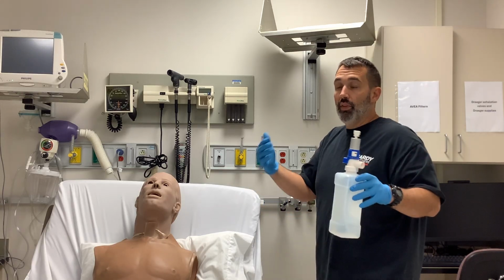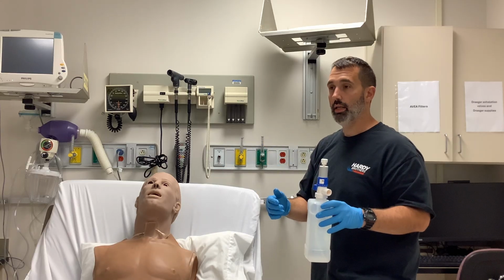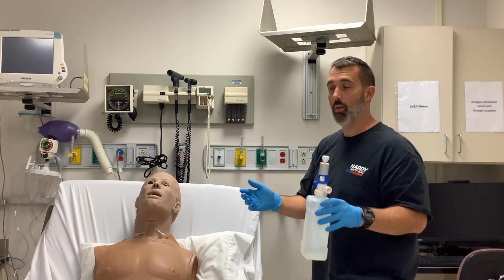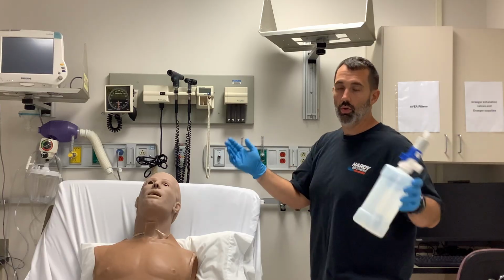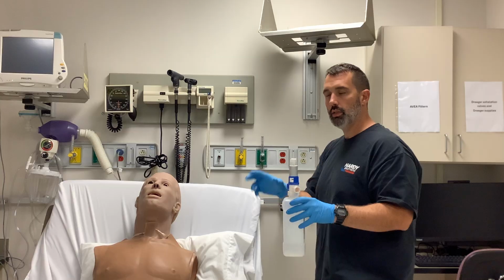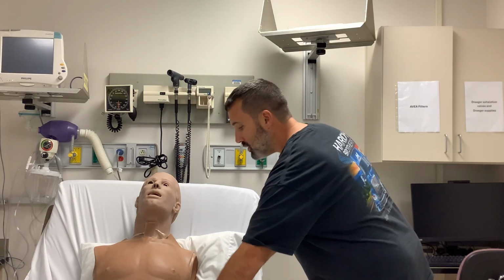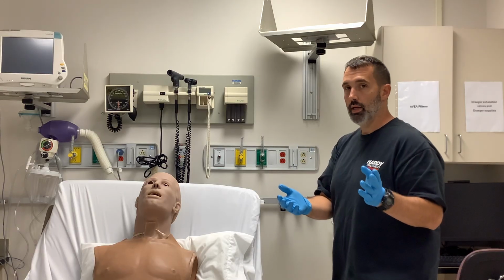And if the kid wasn't able to flush the CO2, we may have had a rapid response a little bit later if the patient became super hypercarbic and ended up not breathing or what have you. So, super important to understand these air entrainment devices and how they work. So we'll just leave it at 40%.